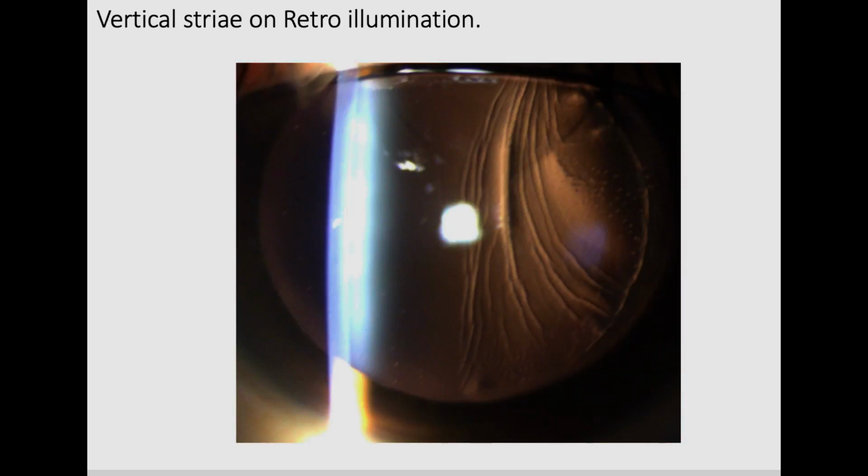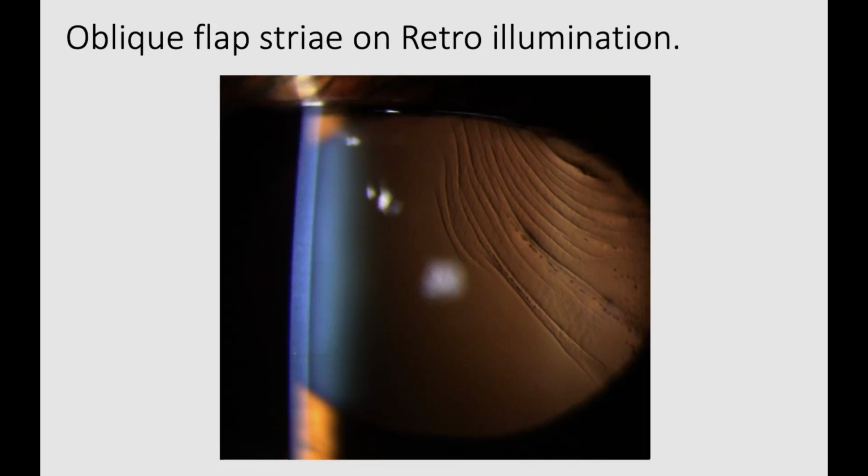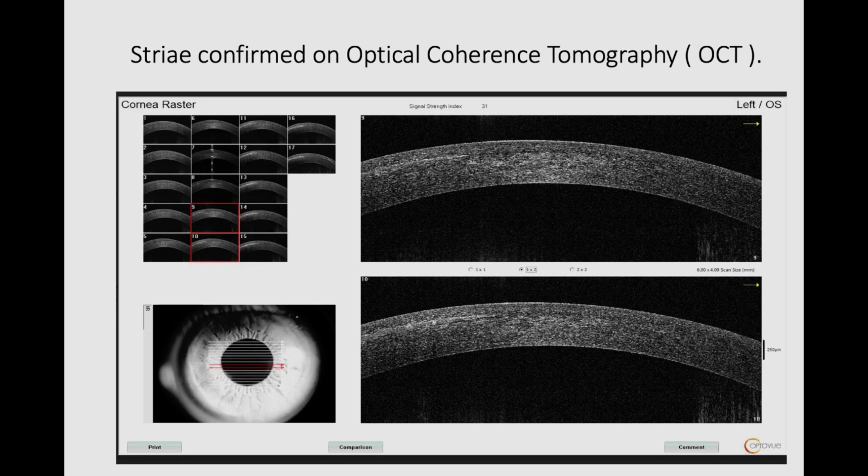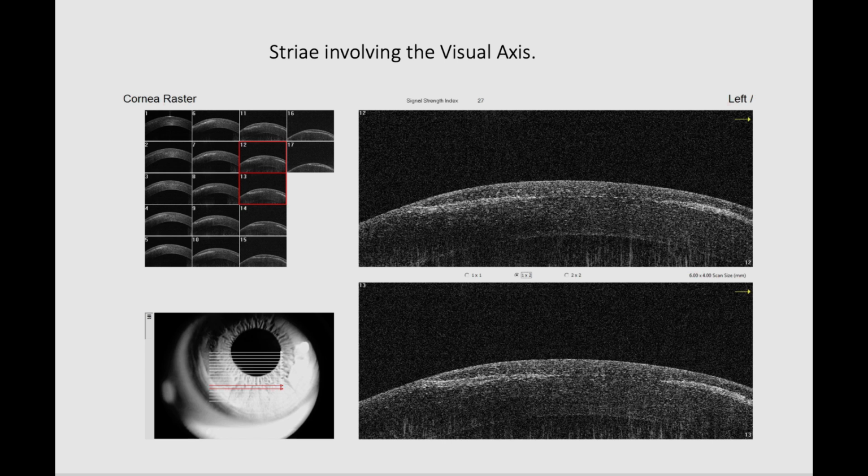I would like to share a few cases where we have used different techniques of managing flap striae in our hospital, depending upon the type and severity of the striae and the post-operative time it was detected. In early post-operative period, these complications are relatively easier to manage.